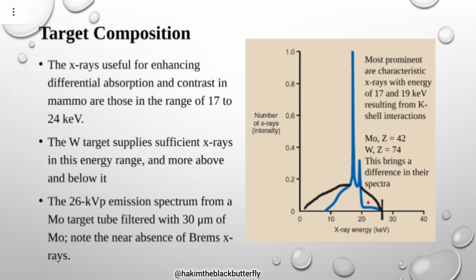What does that mean? Sorry about that. So I was still explaining about the K edge. Now, these electrons, because of their binding energy, which is about 20 kilo electron volts, it means that any X-ray photon that comes with such amount of energy or slightly higher is going to be absorbed photoelectrically.